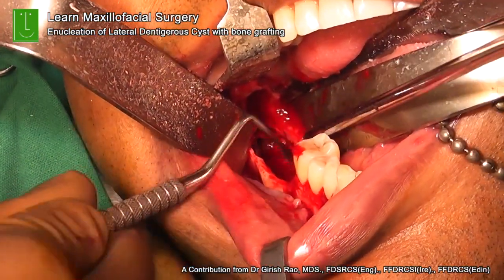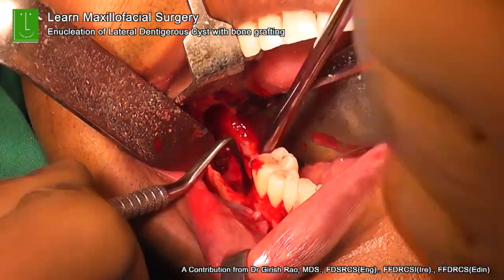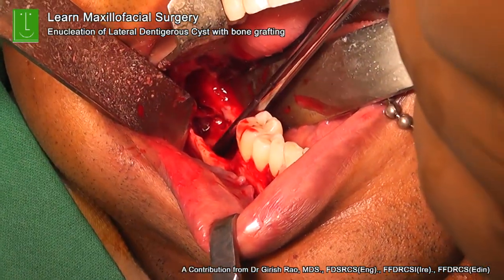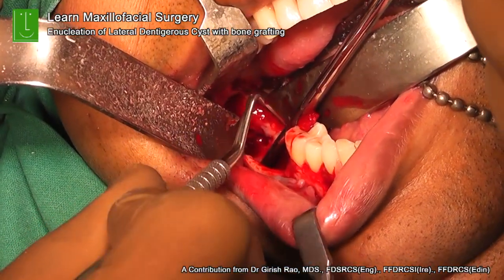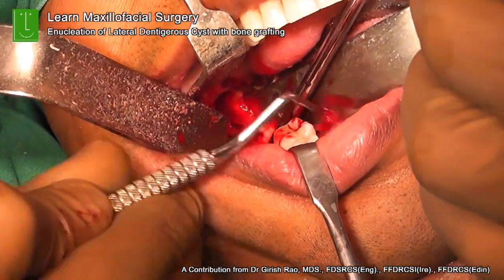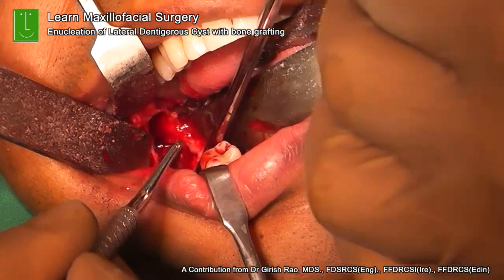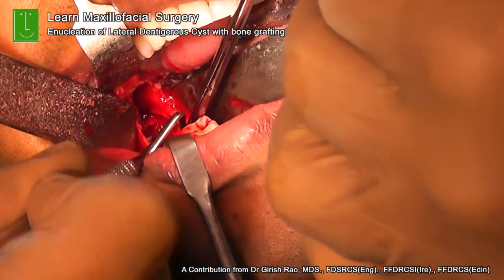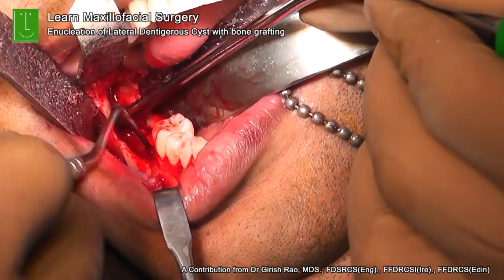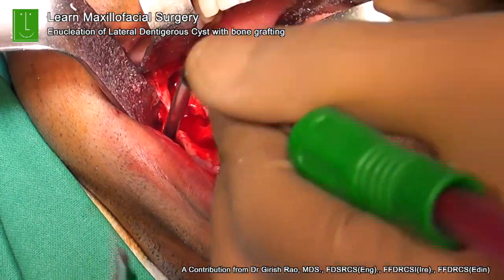Many a time you can have even perforations below, where you have the canal, the inferior alveolar canal. So in this case also there was a perforation of the canal, which is the reason why we need to be extremely careful with the curettes. You need to take out the cyst lining, but at the same time you should not damage the neurovascular bundle. So very gentle teasing. Most of the time the cyst tends to come out pretty easily. Be very meticulous and do a thorough curettage.